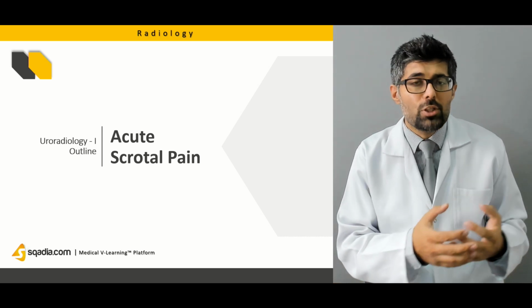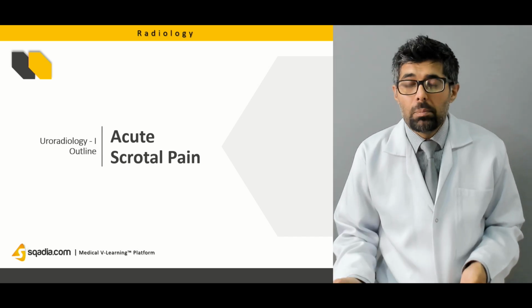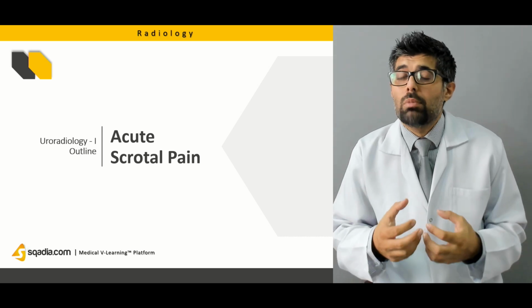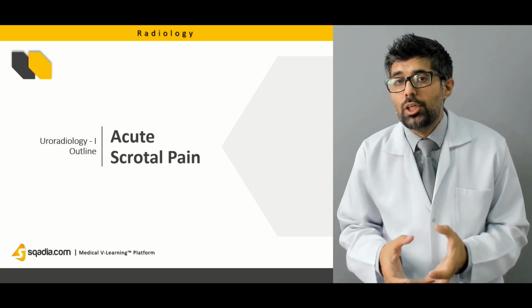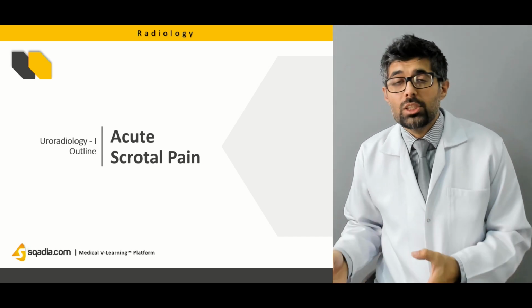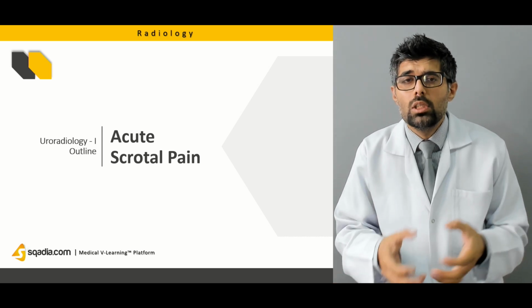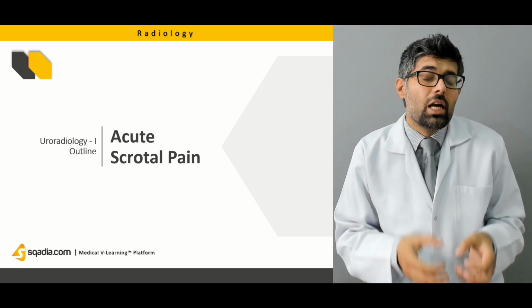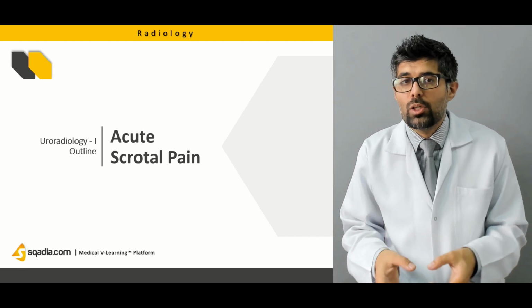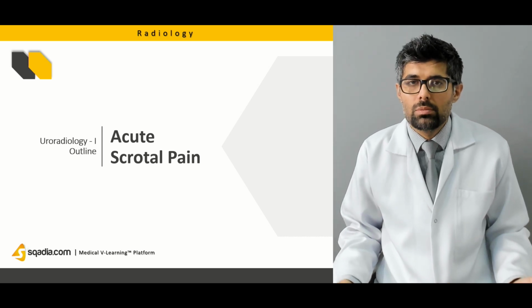Now, which conditions lead to scrotal pain, which inflammatory diseases can lead to such pain, we'll study about all of those. We'll study about which kind of modalities to use, what is the difference between a normal ultrasound, a Doppler ultrasound, and a duplex one, and how we can use these to differentiate between an epididymitis or a testicular torsion.